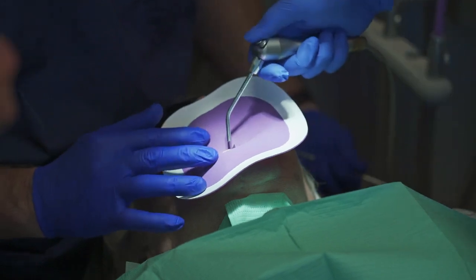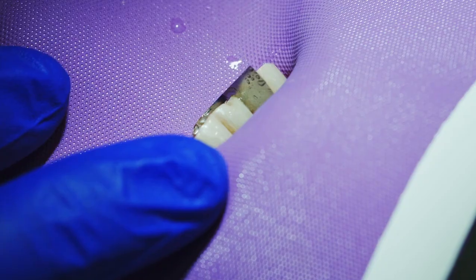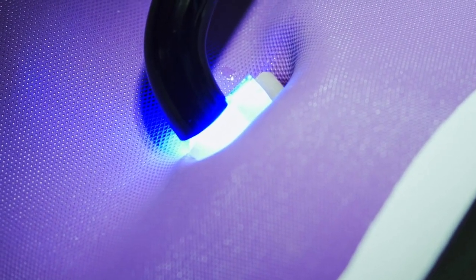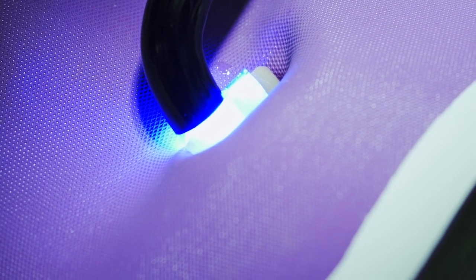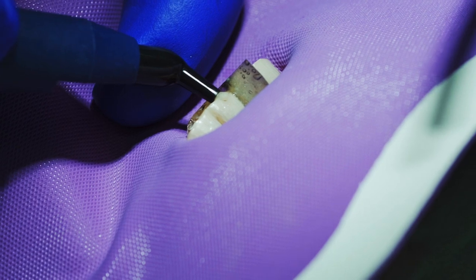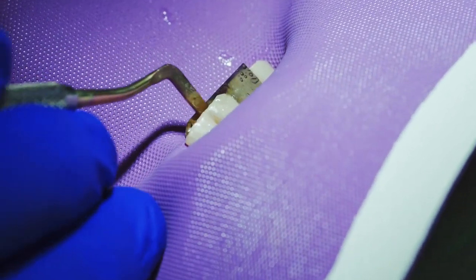Now we'll just proceed with whatever composite resin that you're using in your office. This product is exceptionally good for the anteriors because it changes the adhesive stress from shear to more of a compressional strength, and it allows the filling to stay in place. I've also placed these in the posterior — it works in any part of the mouth. I've used multiple glass pins to act as scaffolding to rebuild teeth.